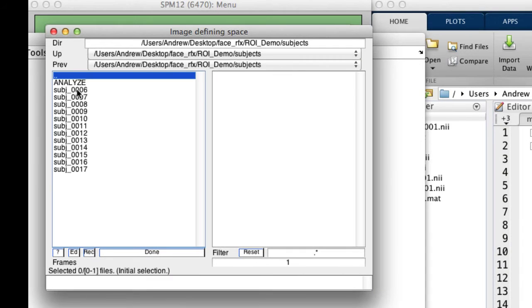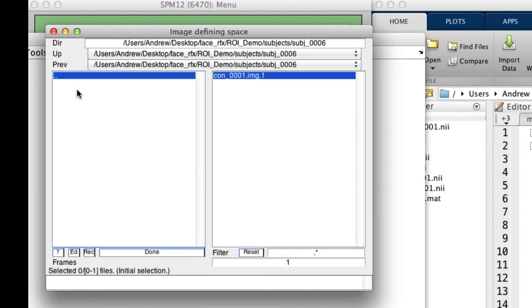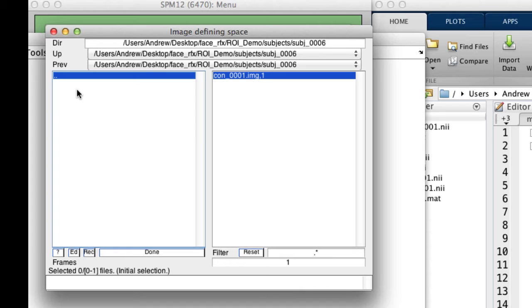In this example, I have only one contrast image per subject to keep it simple. The reason I'm selecting a subject's contrast image as my base space is because I want to make sure the ROI has the same size and dimensions as the contrast that went into my second level analysis. Otherwise, the ROI analysis won't work.